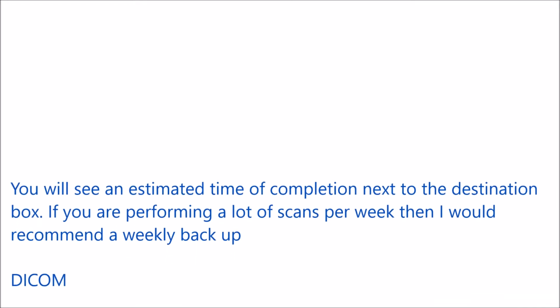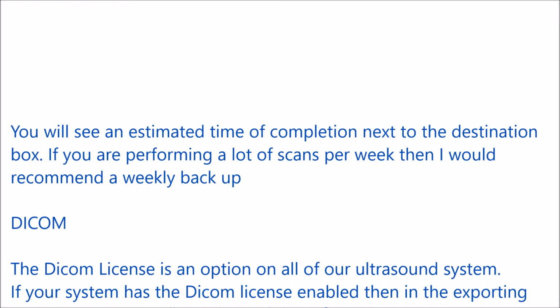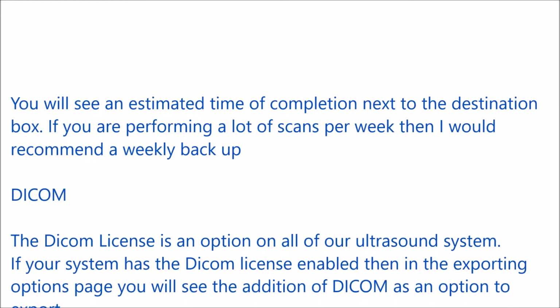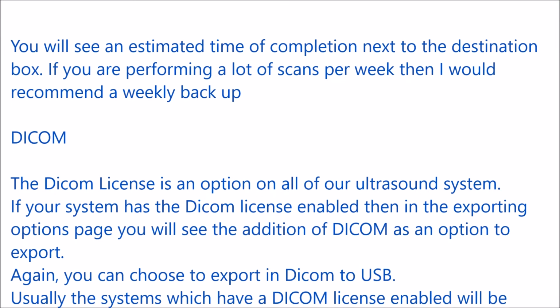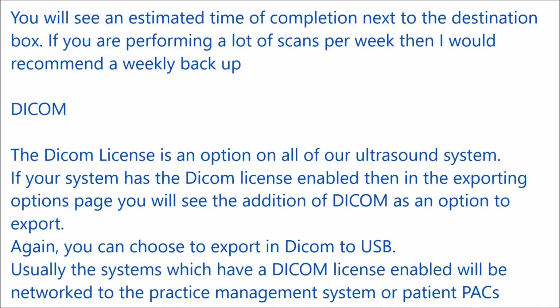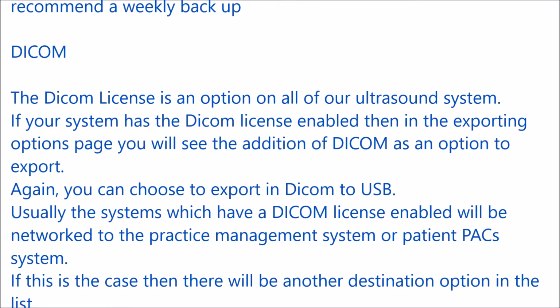Okay, let's come back round to DICOM. The DICOM license is an option on all of our ultrasound machines. If your system has the DICOM license enabled, then in the exporting options page, you will see the addition of DICOM as an option to export. Again, you can choose to export in DICOM to the USB.